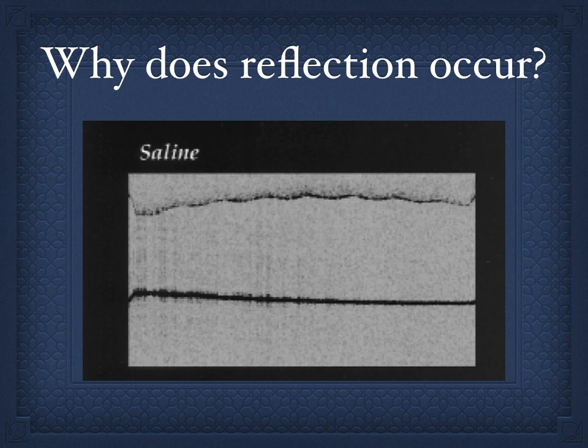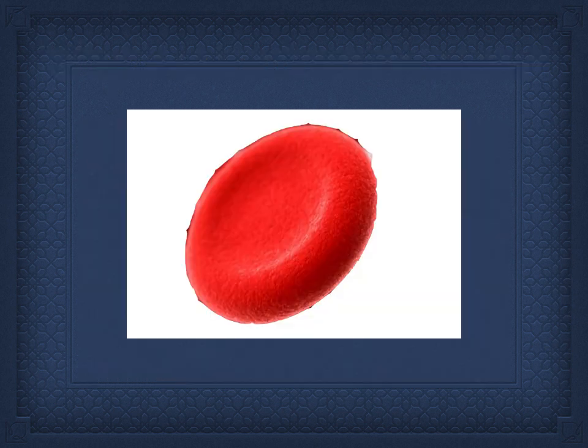If you have two glass slides with an air gap in between, you see the surfaces between the slides with OCT, because the air and the glass have a different refractive index. If you take those same glass slides and press them together, you do not see any reflections from the surfaces that are in contact, because it's glass on glass, equal refractive index, so it will be transparent. So when we look at the red blood cell, we have a refractive index inside the cell and a refractive index outside the cell. And it has nothing to do with cell membranes or organelles.